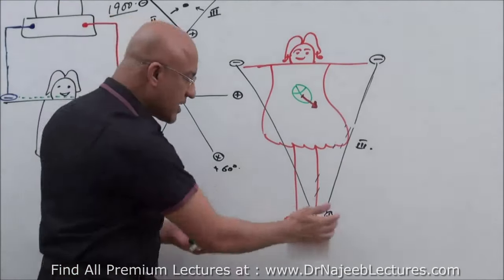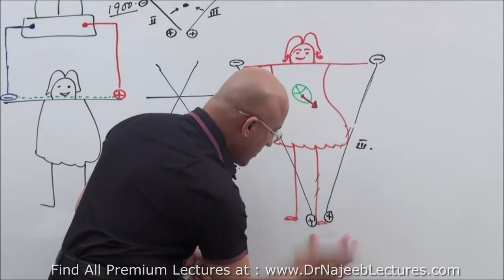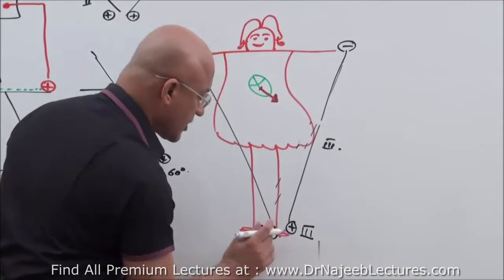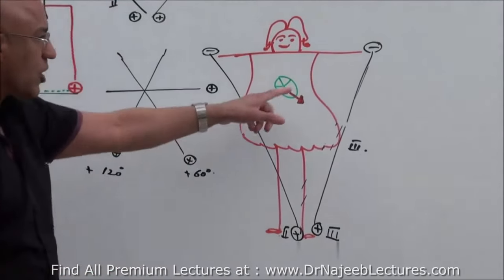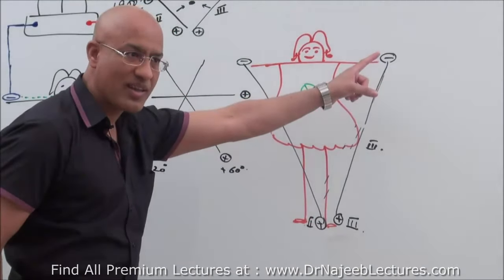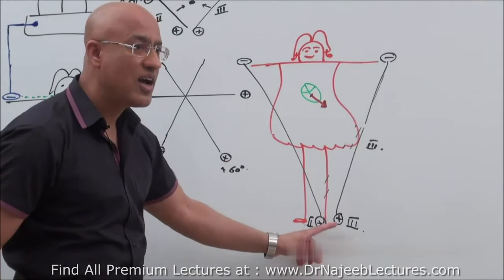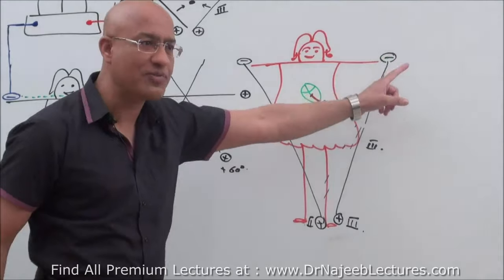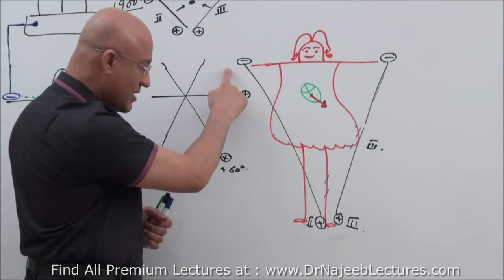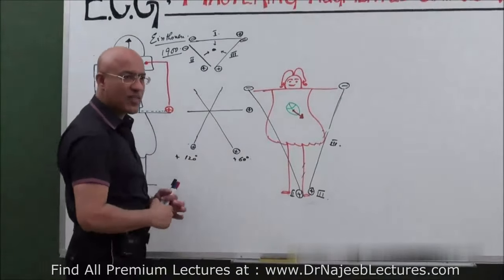Right? Boy number 3, this is boy number 2, and here is boy number 3, bipolar limb lead number 3. It is also trying to look at the electrical activity of the heart, but its electrical axis of the lead, or angle of vision of the naughty boy, is upward and leftward. Now you see it, this is looking upward and rightward, look. And this is looking upward and leftward.